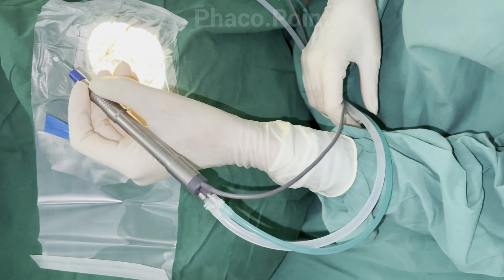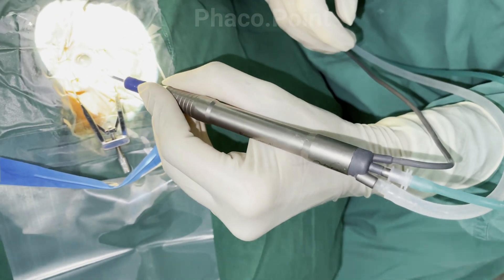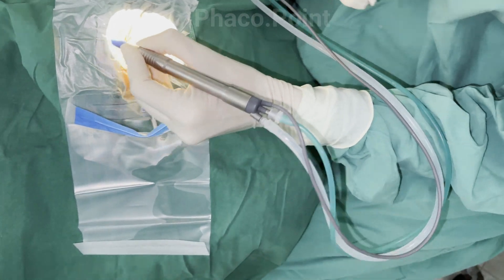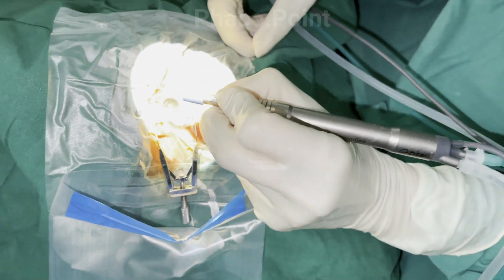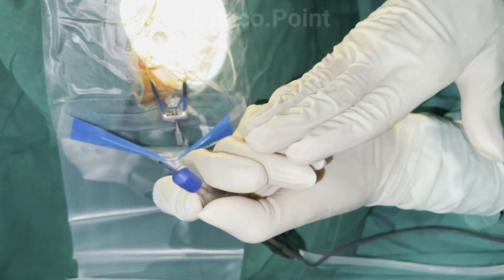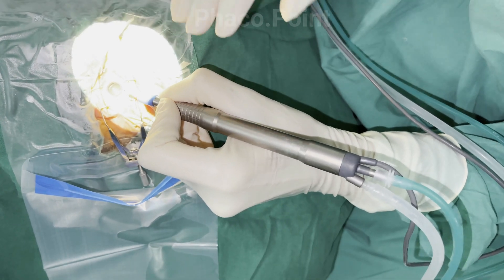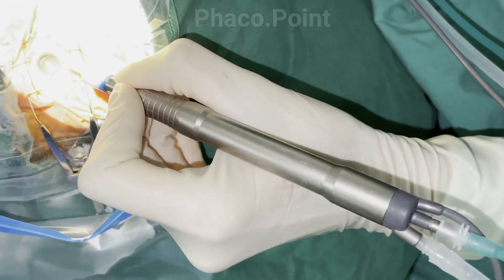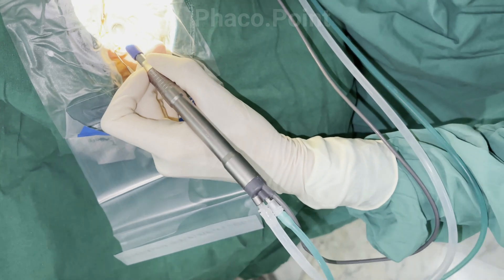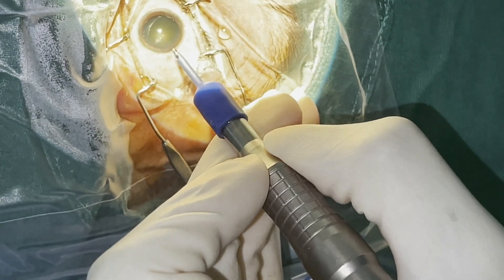The handpiece is held like a pen — firmly and steadily. The tubings are always kept a little slack to avoid unnecessary kinking during the procedure. For a surgeon sitting superiorly, as I do — being left-handed and working through an incision at 65 degrees — the hand is folded over and placed on the patient's brow, providing extra support to stabilize the handpiece. This support advantage is generally not available for a surgeon sitting temporally, where there is no corresponding brow to rest on, making stabilization more challenging.